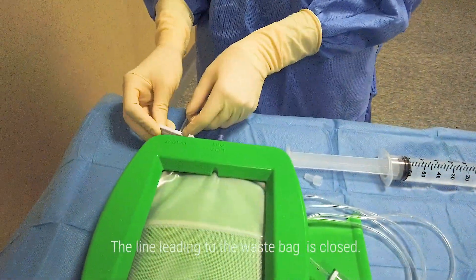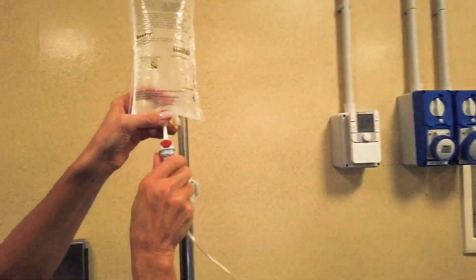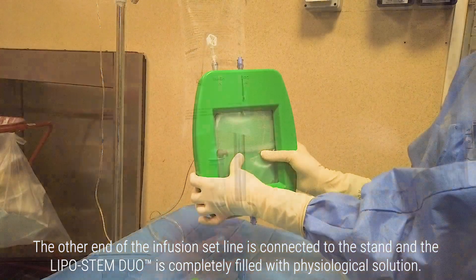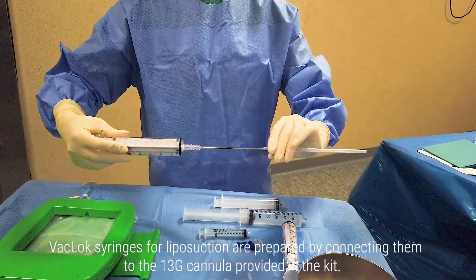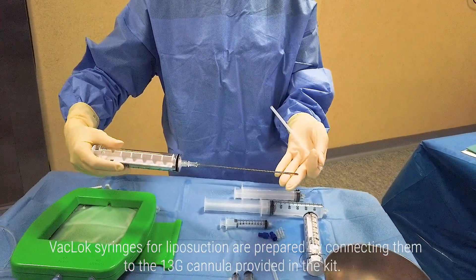The line leading to the waste bag is closed. The other end of the infusion set line is connected to the stand, and the Lipostem Duo is completely filled with physiological solution. VAC lock syringes for liposuction are prepared by connecting them to the 13G cannula provided in the kit.